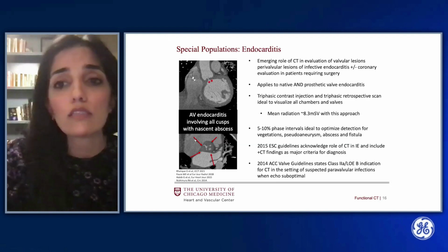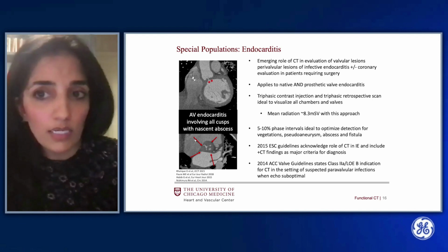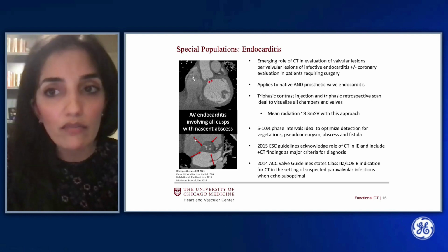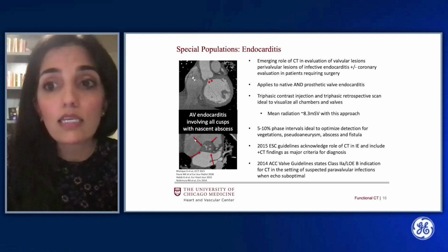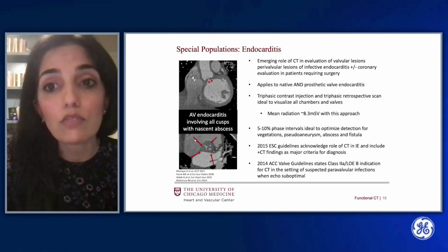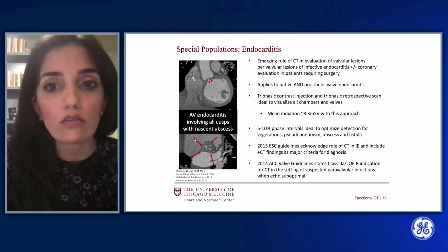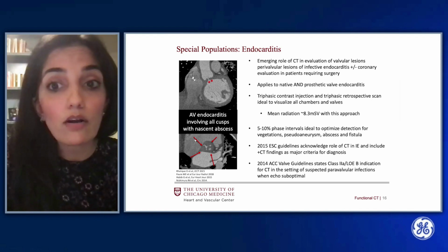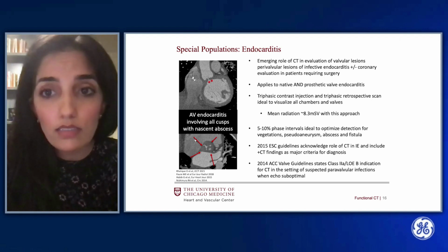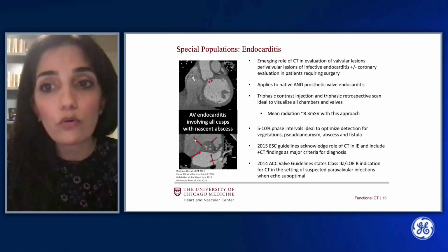Another valvular disease well served by the use of dynamic CT is endocarditis, as CT permits evaluation of both valvular and perivalvular lesions in patients who have either known or suspected endocarditis. CT can additionally be used for a non-invasive coronary evaluation at the same time in patients who may require cardiac surgery. CT can be harnessed in both native and prosthetic valve endocarditis, but again, specific considerations should be taken in the protocol for image acquisition in these patients.